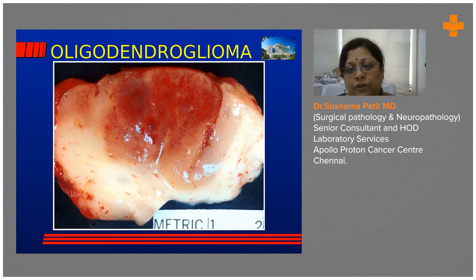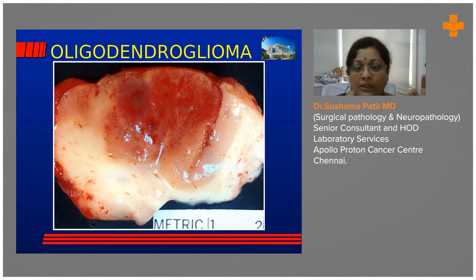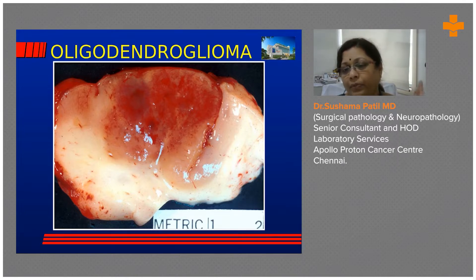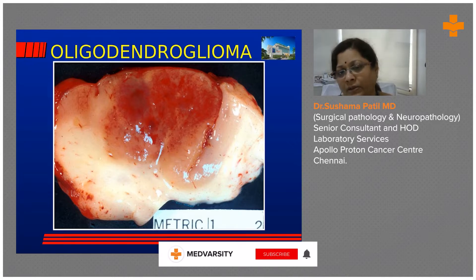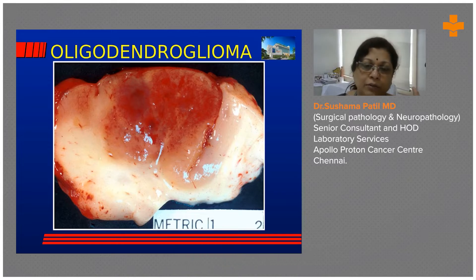Oligodendrogliomas come to attention very quickly because they infiltrate the cortex very fast, causing seizures. Seizures are a very prominent early symptom of oligodendroglioma, so they come to medical attention very quickly. This was the surgical resection specimen — you can see beautifully the tumor reaching all the way up to the surface, near the upper limits of the slide. This is a beautiful gross specimen of a glioma.